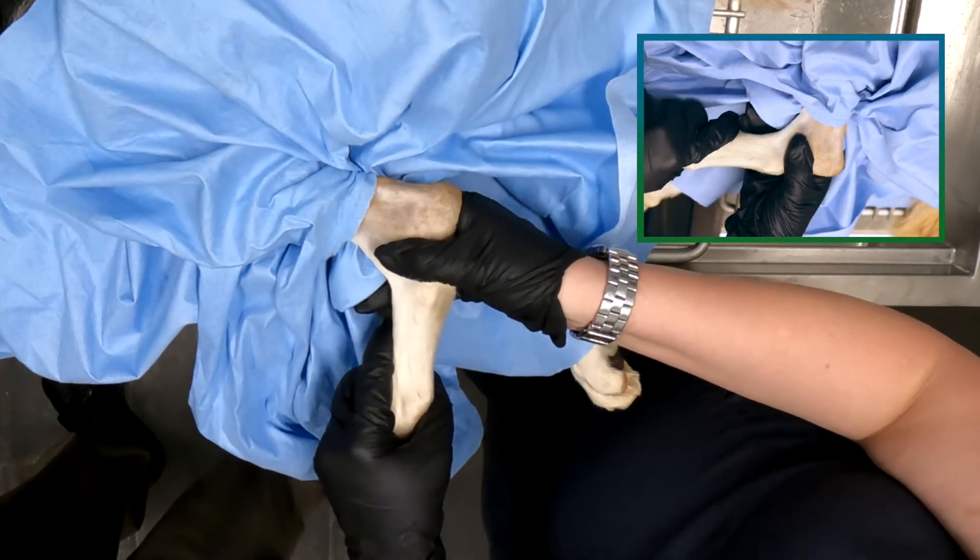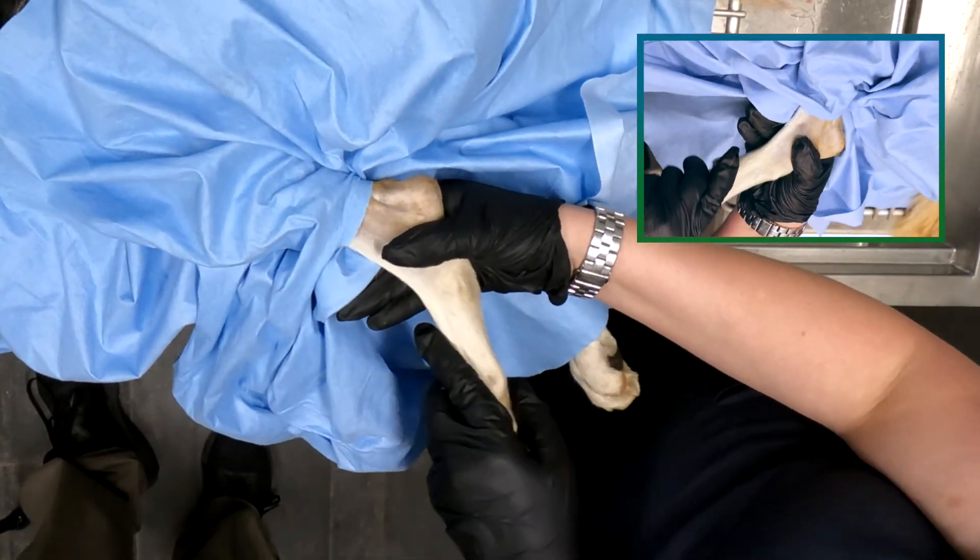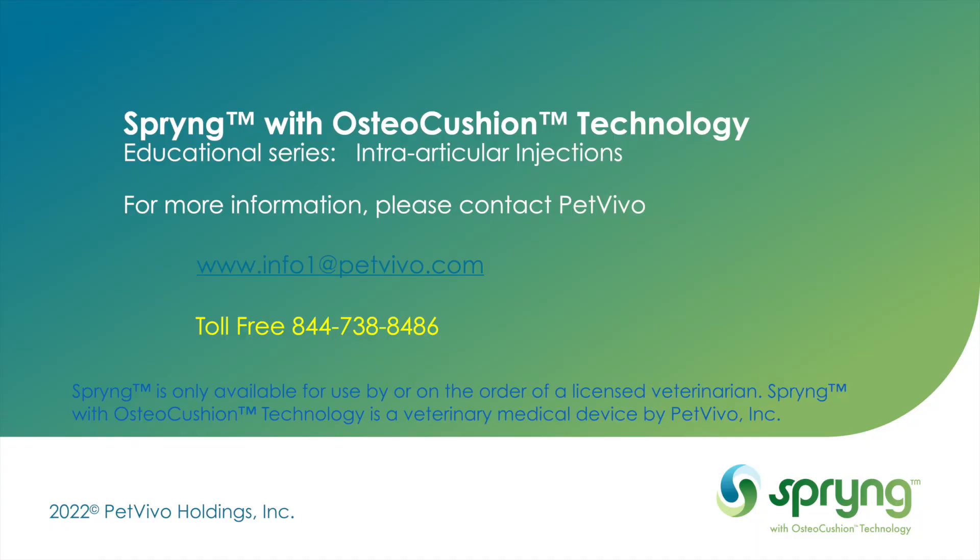After your injection, perform gentle range of motion two to three times to distribute your product.